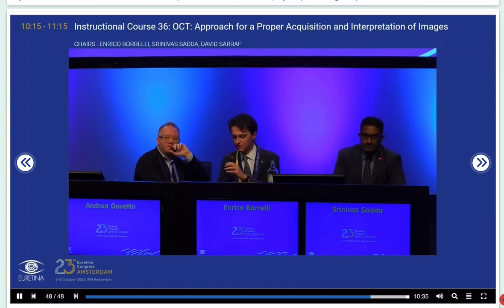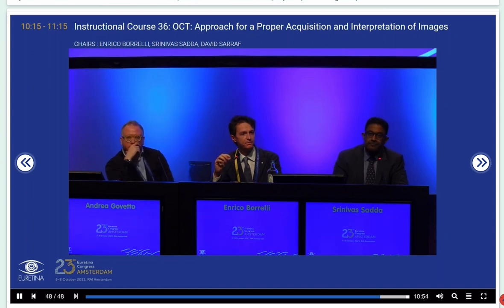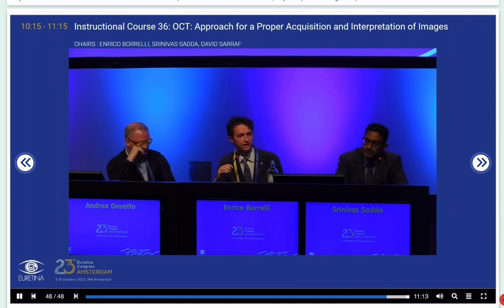Thank you. So thanks for your comment. I will say that standardization is one of the most important aspects when we see OCT and OCTA images. Regarding the other two questions, the flat PED may be characterized by the presence of hyperreflective material, and this double layer sign may be a thin double layer sign or a thick double layer sign, but in both cases there is a flat PED. And finally, the intraretinal cyst is for sure an important terminology, and may be associated with exudation, but also with other causes. So this is something I will need to highlight more in the next presentation.